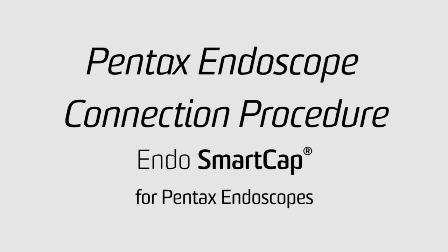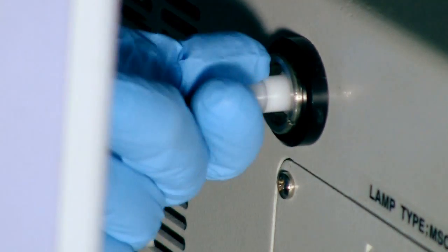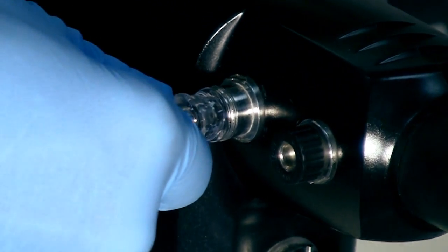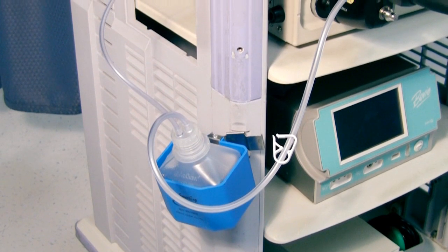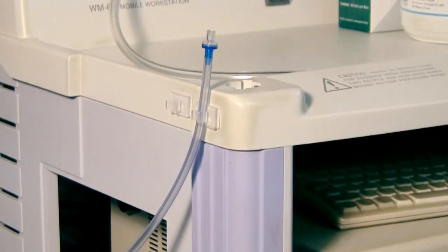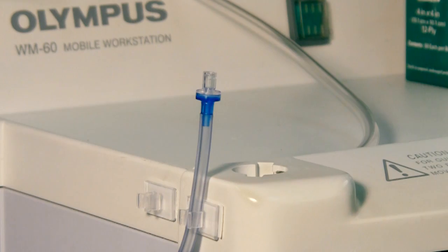With the Pentax processor, its design requires two connections rather than one. First, take the plastic white connector and connect it to the air pipe on the side of the Pentax processor. Then, take the scope connection of the Smart Cap and connect it to the circular air-water connector on the Pentax scope. When using the CO2 Smart Cap with Pentax scopes, you connect the Smart Cap to the scope the same way. However, instead of connecting the plastic connector to the air pipe next to the processor, you will use the CO2 luer lock version and connect it to your CO2 source.